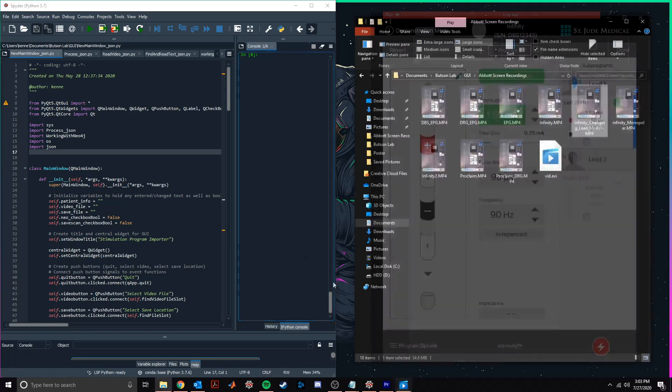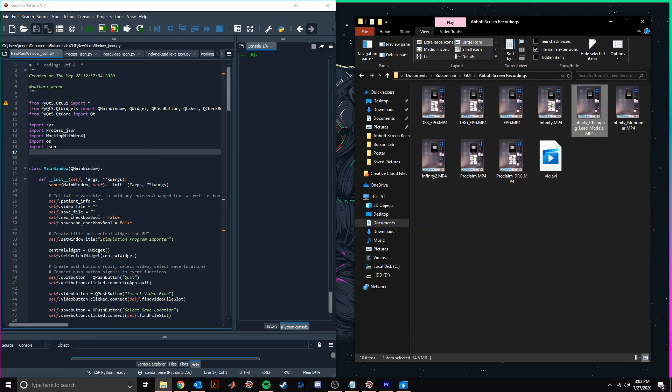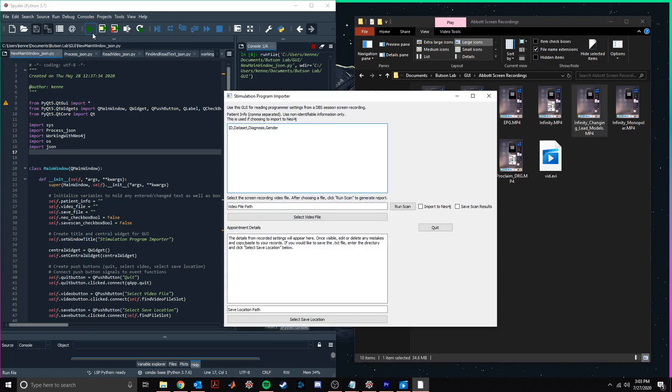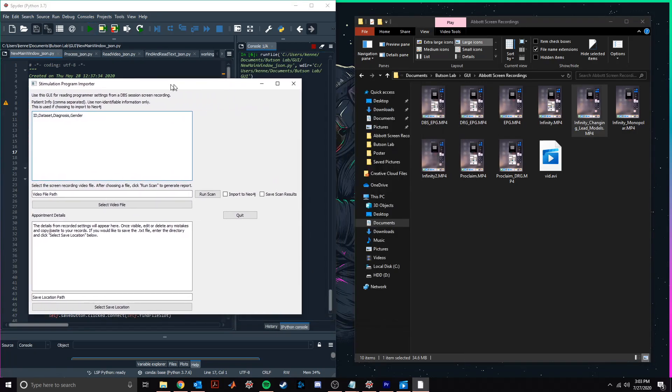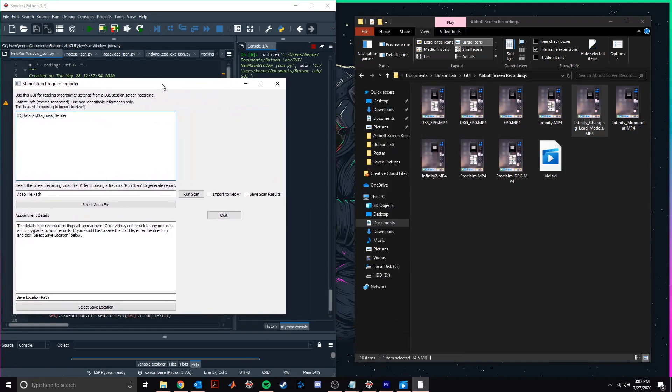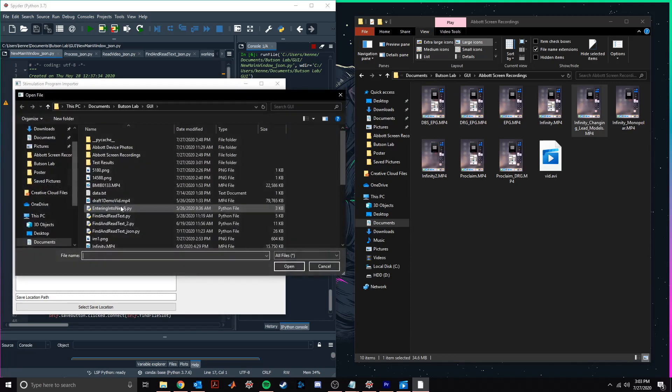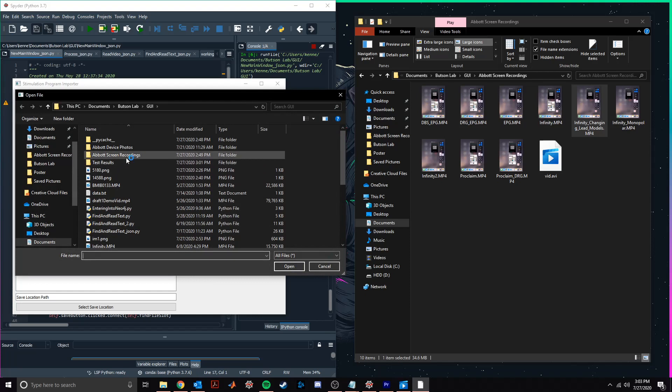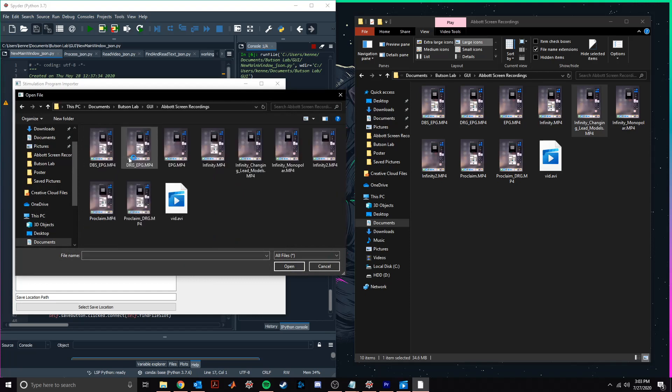Now that you have an idea of what settings can be changed throughout a device programming session, we'll run our device reader software. Upon running the script, a user interface is generated where we can change some software settings. First, we'll choose the screen recording that we want to read settings from.